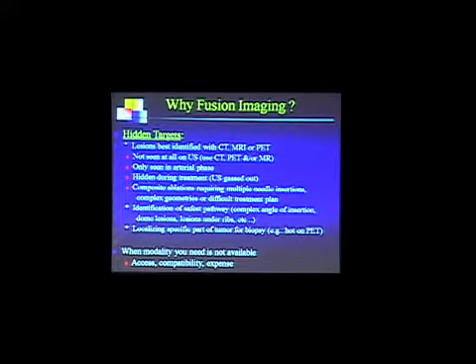Lesions hidden during treatment because of a gas. Identification of the safest pathway to the lesion. Localizing specific part of the tumor for biopsy. And I will show you briefly a few examples.